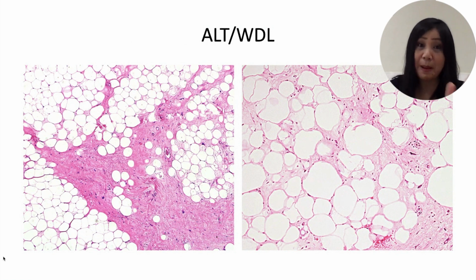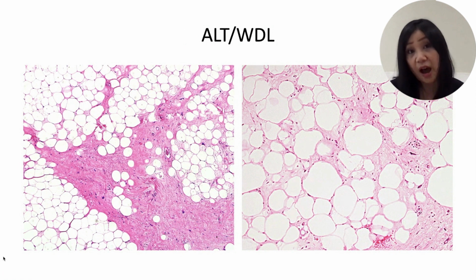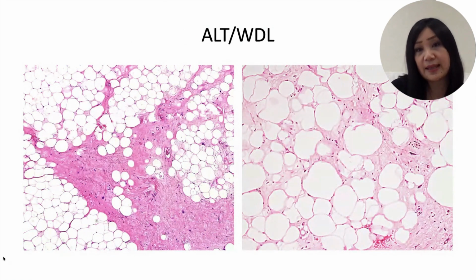So we can see it here, very typical. Remember this typical morphology of well-differentiated liposarcoma, which comprises sheets of adipocytes of mature type, with variable but essentially prominent intersection by relatively sparsely cellular collagenous fibrous septa. In these fibrous septa, we can see scattered atypia at low power. This is what Prof has always taught us, training under him: you can see the atypia in the septa, even at low power. We can appreciate scattered cells in the fibrous septa which have hyperchromatic spindle and ovoid nuclei. On the right, we can see another example, which is more subtle, but there is variable septation and there are occasional hyperchromatic, moderately atypical spindle cells intermingled.